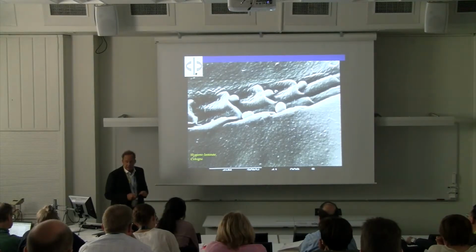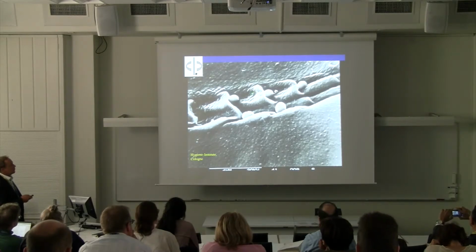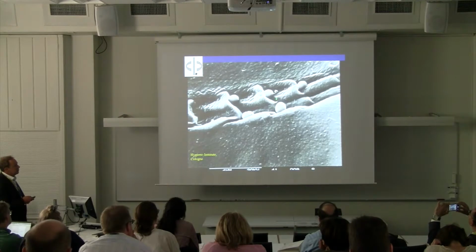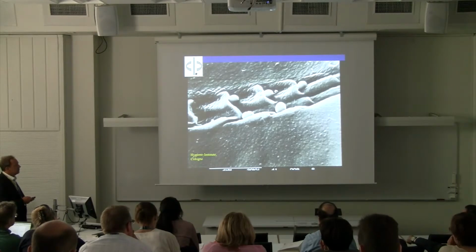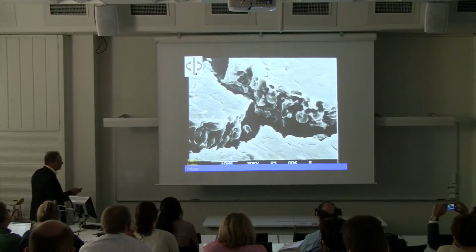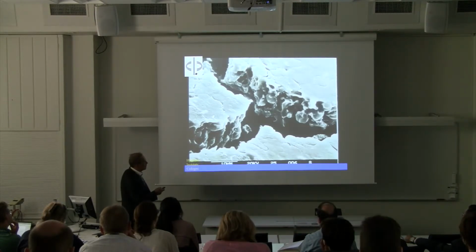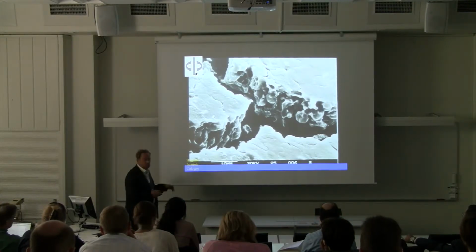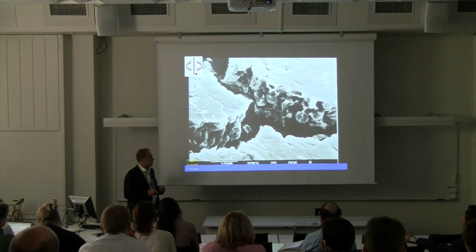This is a very old but very nice electron microscopy picture of staphylococci adhering to the surface of a catheter. Only some bacteria adhering to such a surface in the body are enough to form such a biofilm after 24 hours. The biofilm consists of an extracellular polymeric matrix, and the staphylococci are embedded in this matrix. This matrix, the so-called slime, is protecting the bacteria from the host immune system as well as from therapy by antibiotics.